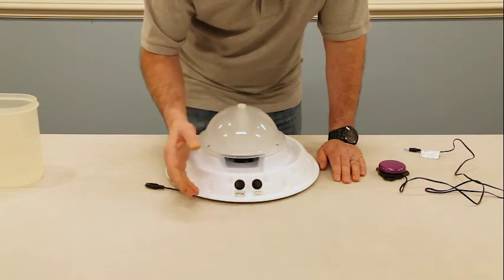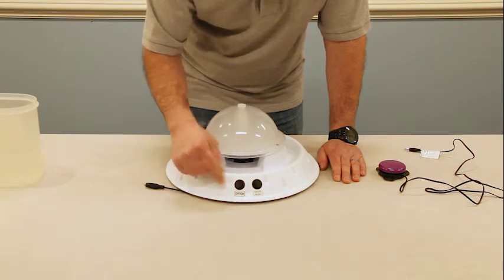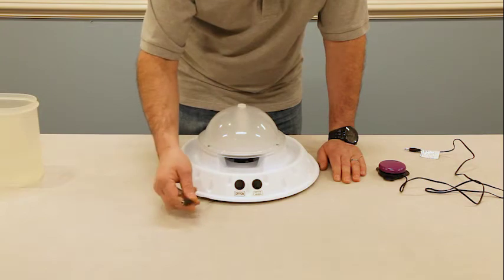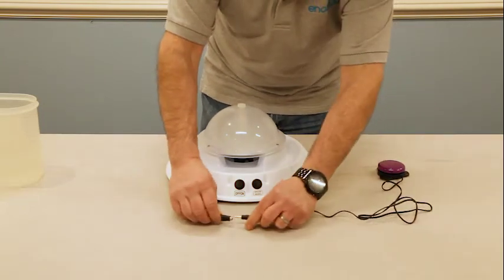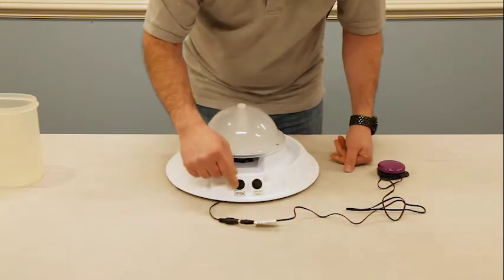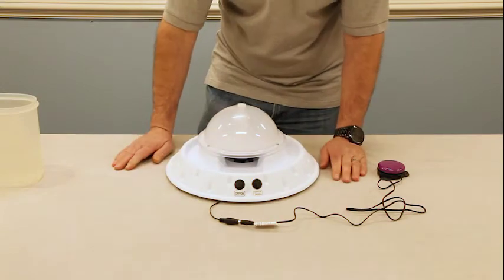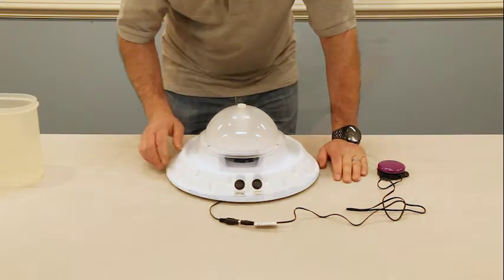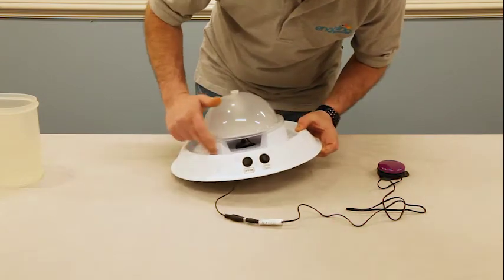We also have an on/off switch for continuous use. It is made for switch access — you can plug in any capability switch — or you can turn it to on and it will run continuously. This does require water; you must fill it up until you reach the bottom of this recession here.